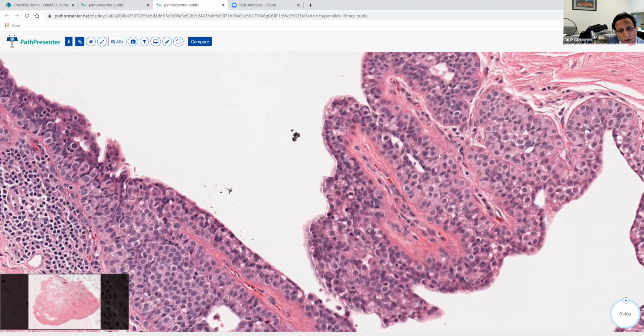But you have to remember that even DCIS may involve a duct in a Pagetoid fashion. I mean, that certainly happens. That is how Paget's disease, right? I mean, the term came about because that is how the DCIS cells creep along the lactiferous ducts and go to the skin surface.